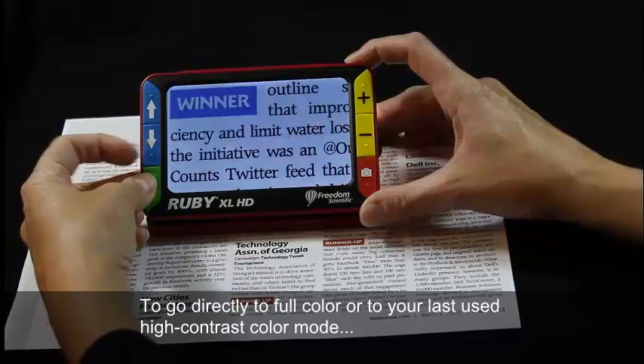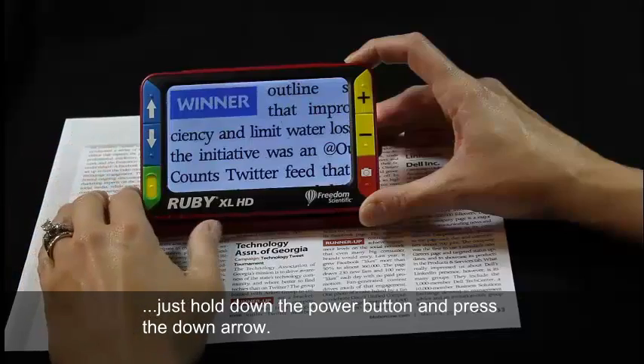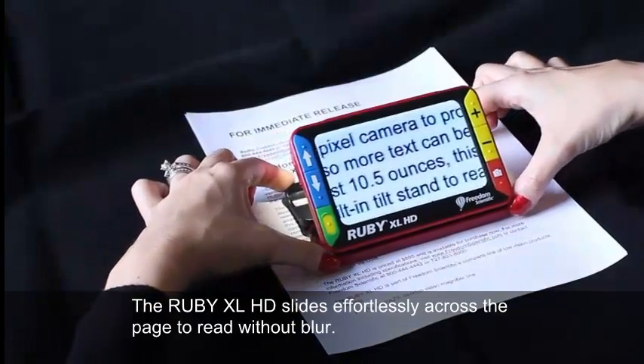To go directly to full color or to your last used high contrast color mode, just hold down the power button and press the down arrow. The Ruby XL HD slides effortlessly across the page to read without blur.